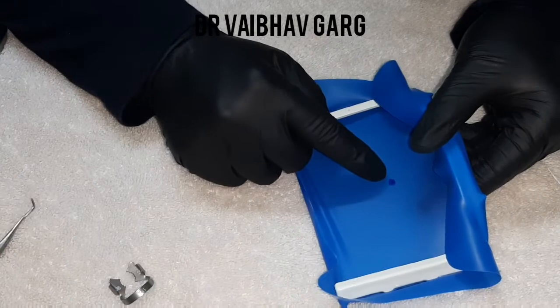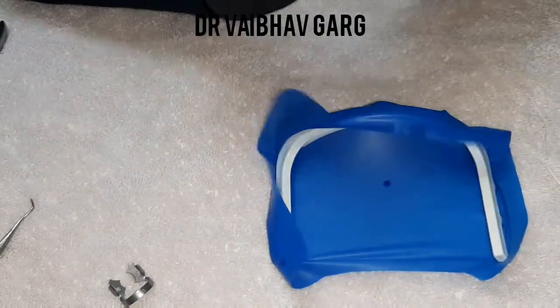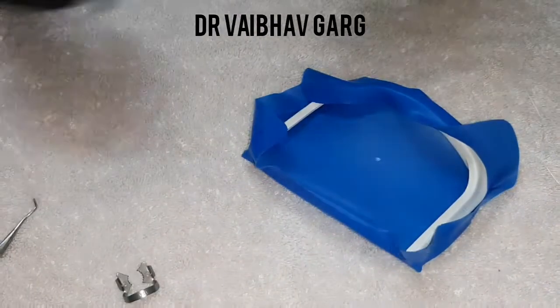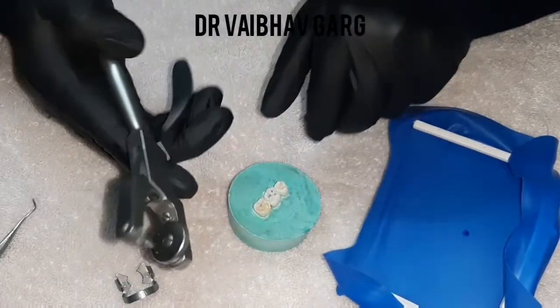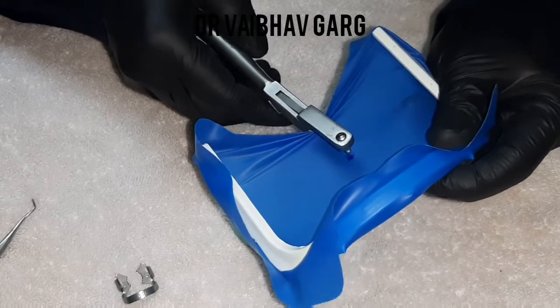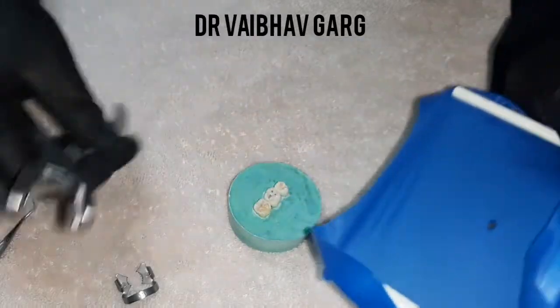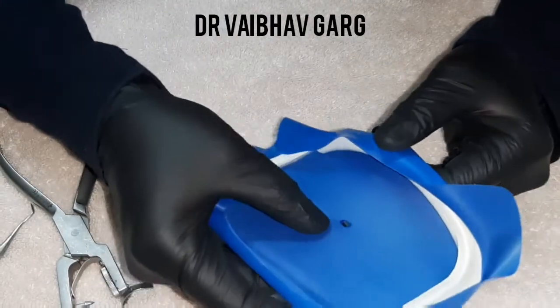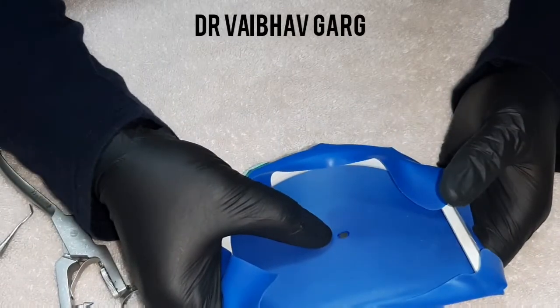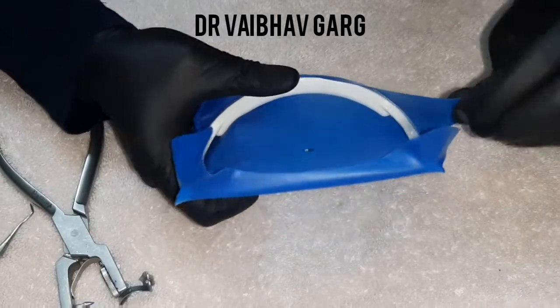We have a small orientation dot here — this is helpful when removing and replacing the same rubber dam. For a maxillary molar, the biggest punch hole is used and I take one and a half size. Some practitioners use the 'Mickey Mouse rule' making three small holes of the same diameter — I do not use that technique, but I have no evidence to say it is wrong. I use my preferred method.